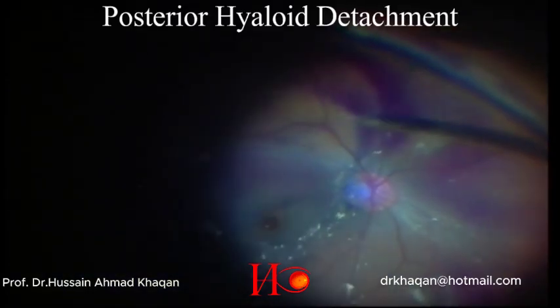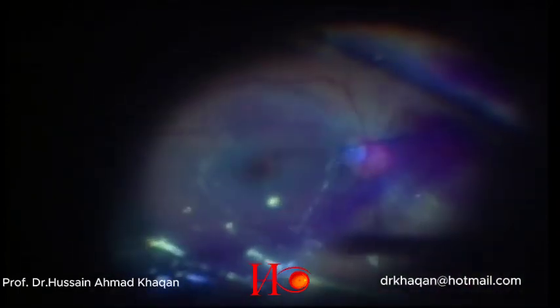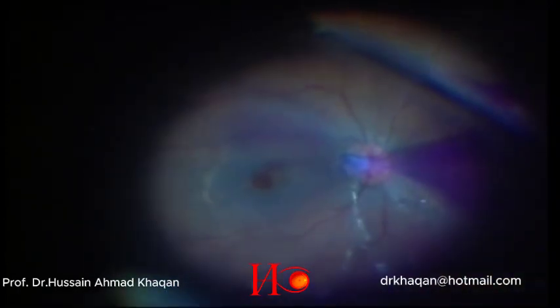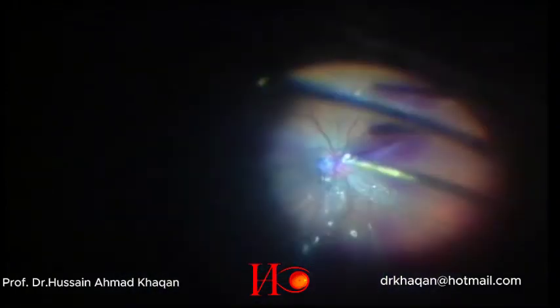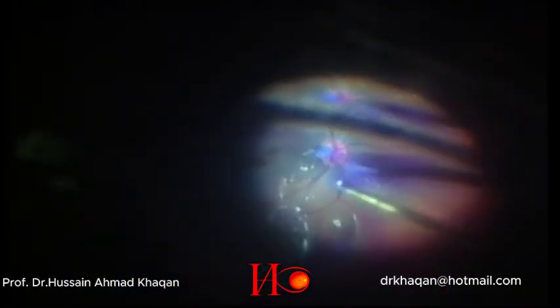While making the temporal flap, I tried once again, and this time I was successful in detaching the posterior hyaloid. So sometimes you have to wait to detach the posterior hyaloid. My air-fluid exchange helped me, and here you can see it is fully detached.